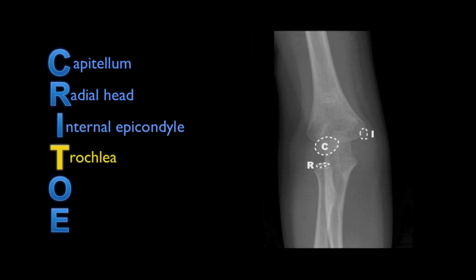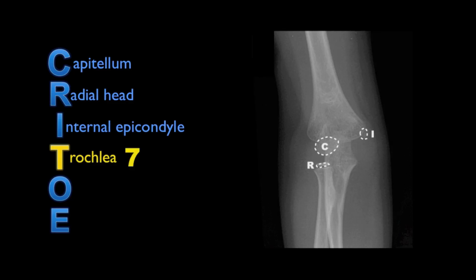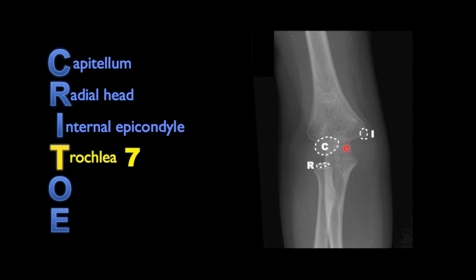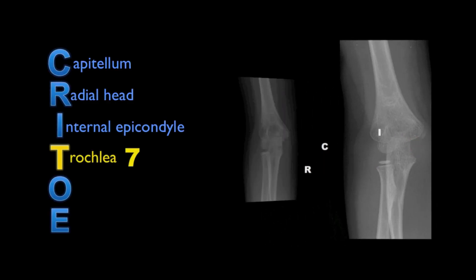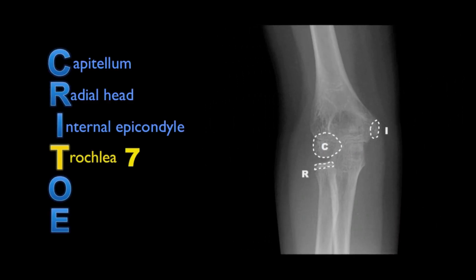The fourth ossification centre to appear is T, trochlea, appearing at around age 7. This child does not have it, so we'll switch to a slightly older child and you can see it here superimposed over the ulna.